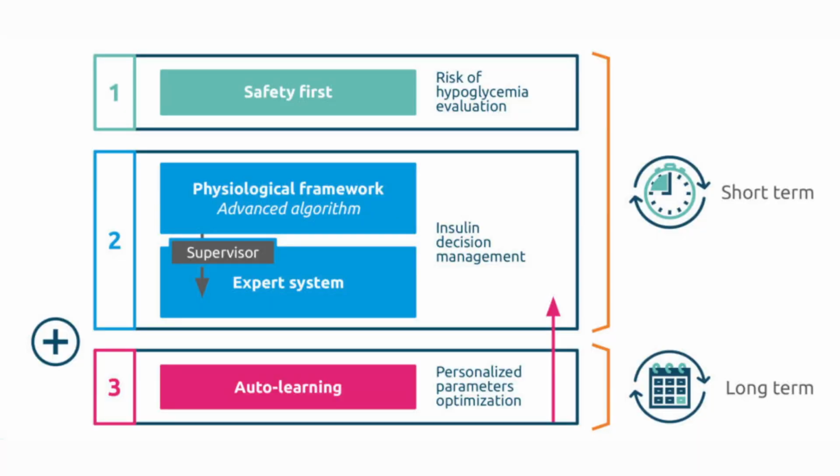Yeah, and I think we need to be careful to say that those systems are not designed to detect every single kind of minor thing that happens. They look at, like you said, a much longer period of time before making these adjustments. And also there is the expert supervisor system. Can you talk about that, which is part of the short-term learning, which ensures that nothing crazy happens internally?